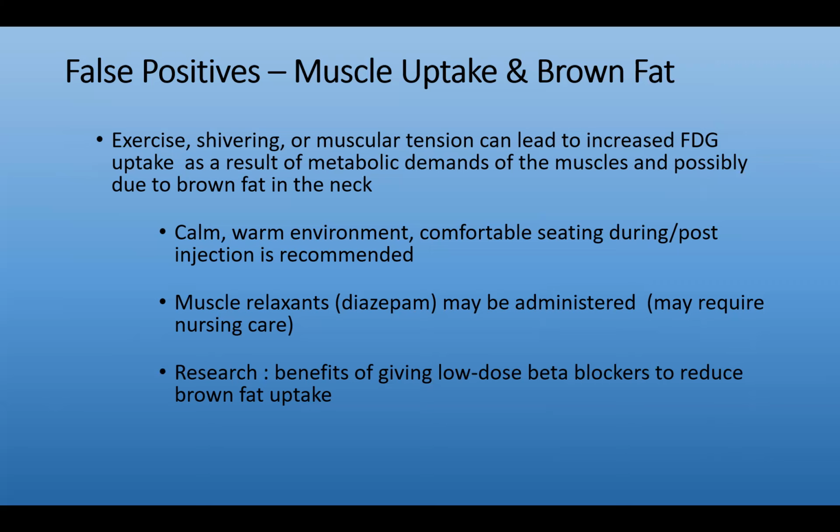There's also been some evidence recently about the benefits of giving low-dose beta blockers to PET patients to try and reduce brown fat uptake. So I don't know that this is being utilized at BC Cancer, but there's been reports in the literature that this is helpful.